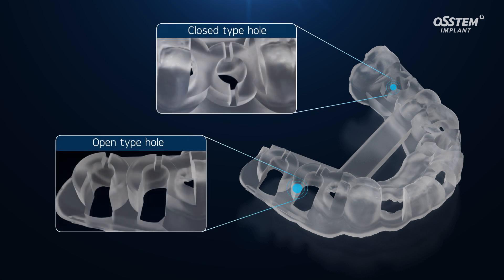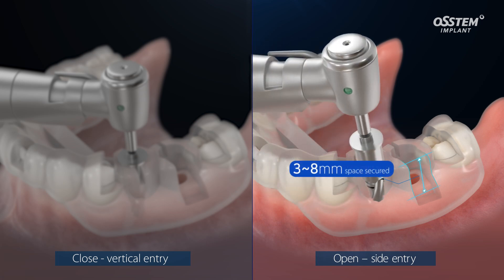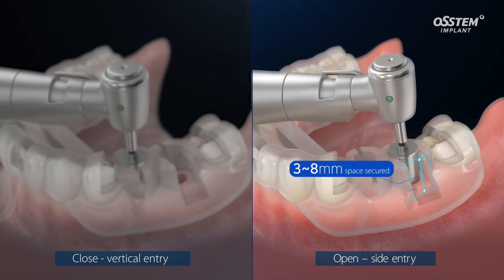In addition to the basic closed type hole, an open type hole can be selected for designing. This function allows drill entry through a site in posterior teeth with insufficient vertical space.